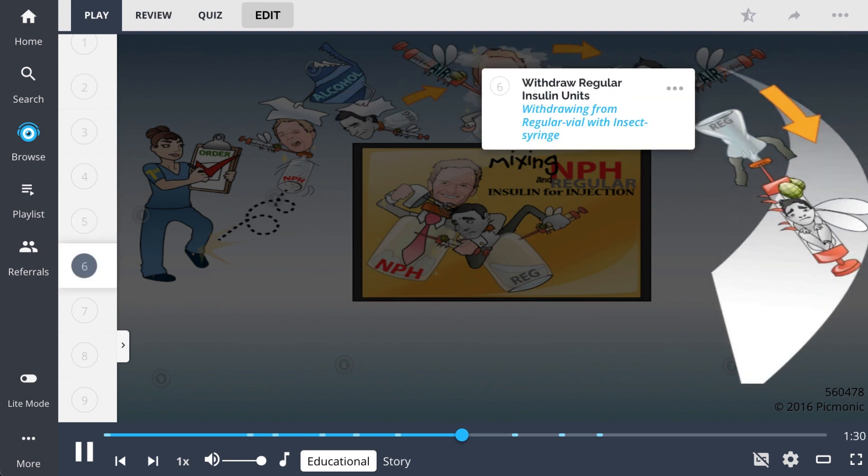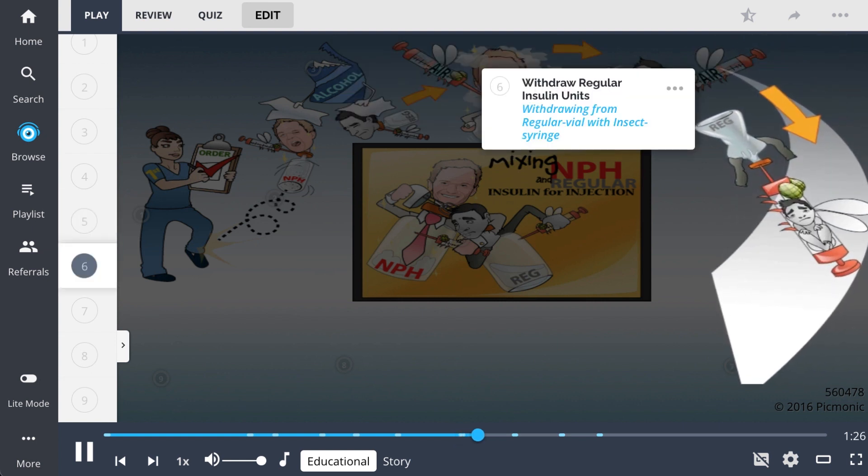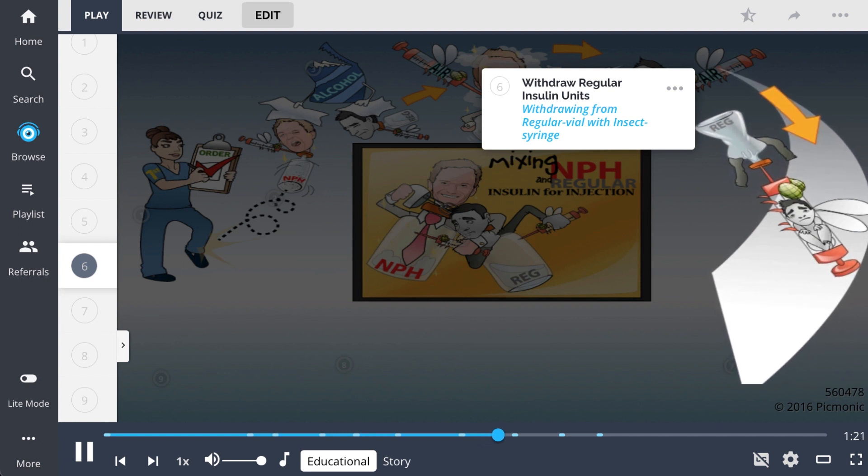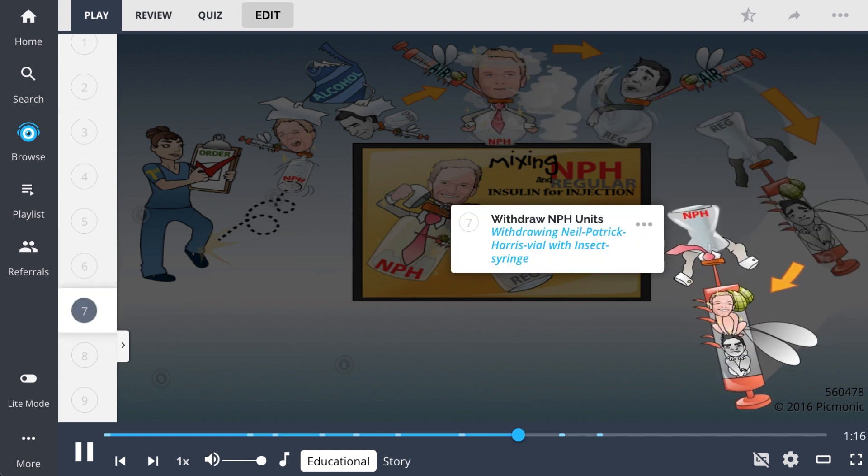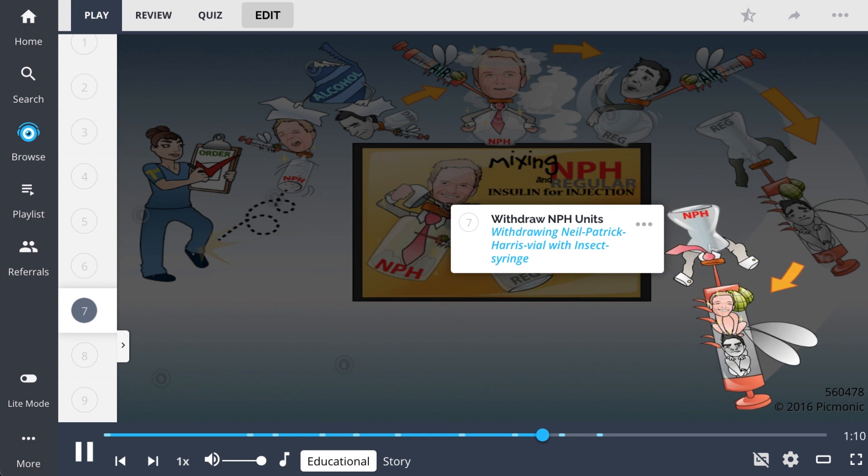The nurse is then ready to withdraw the units of insulin ordered from each vial. Withdraw the regular units, withdrawing the regular guy first, by inverting the vial and withdrawing the insulin. Once the regular is withdrawn, you can withdraw the NPH into the same syringe, shown by withdrawing Neil Patrick Harris second to sit on top of the regular guy's shoulders.